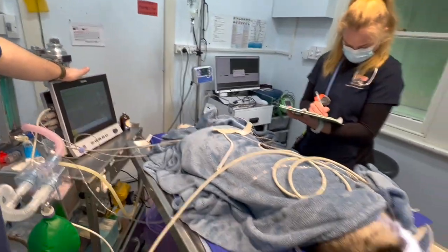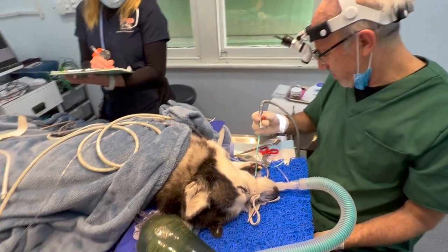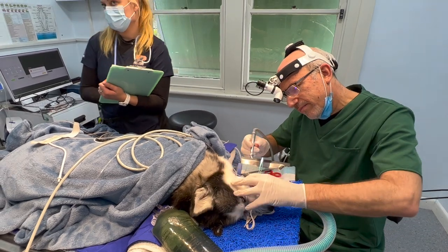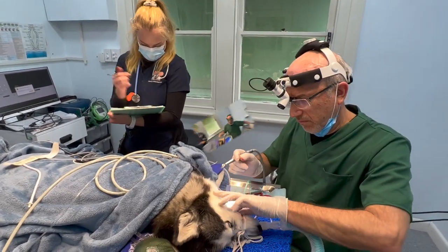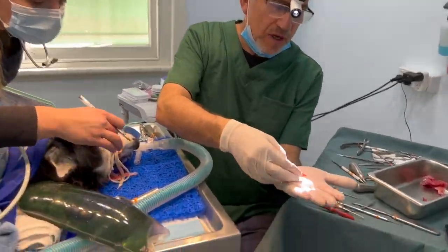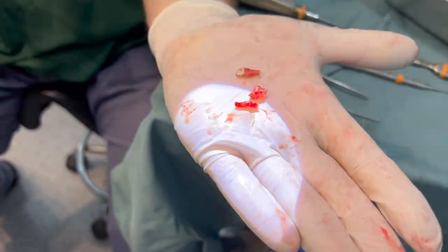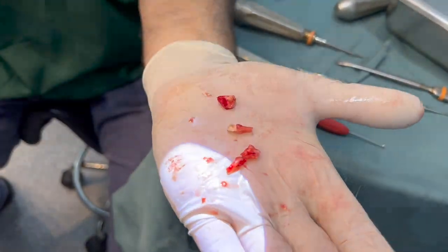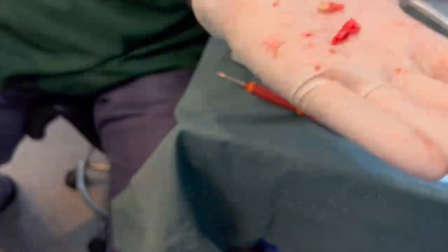We're very happy that the owner trusts us — he's come from a distance, he's actually one of my mates. We've taken out the three-rooted tooth. If you can try and see, that's one of the roots. That's another tooth with the root tip that comes out with it. And there's the third tooth, with a tiny root tip we took out as well. You have to take out all three pieces and the root.